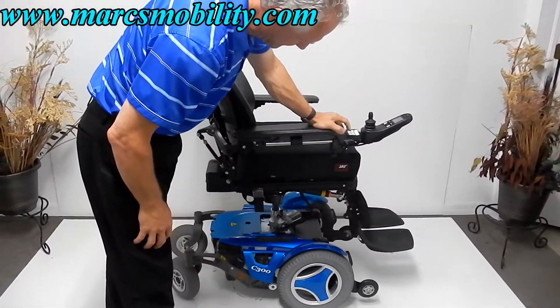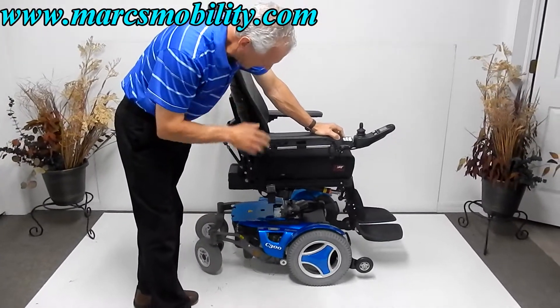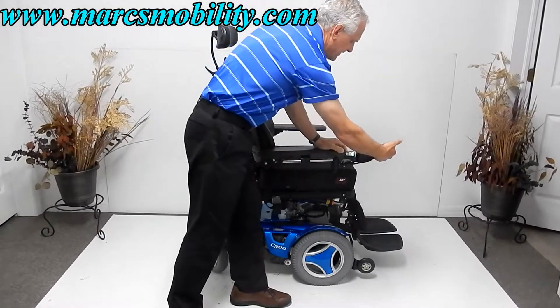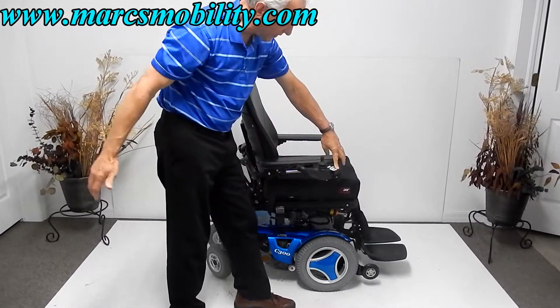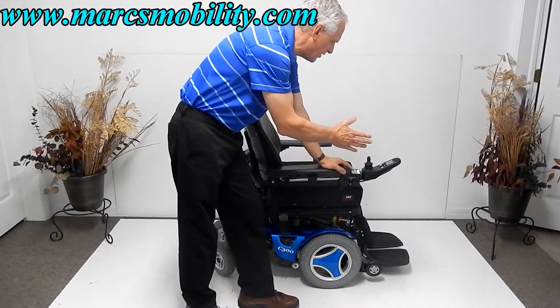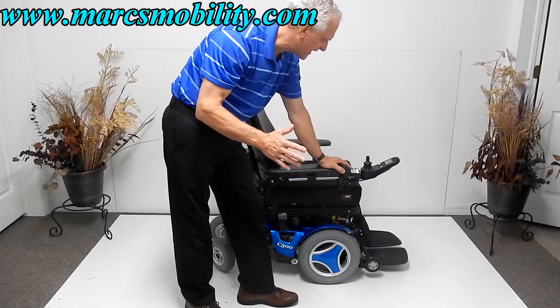I'm going to bring the seat back down. Those are solid tires. This is a swing-away joystick, so you can swing it away from the front. The joystick can go on the right or the left — just let us know which side you want it on.